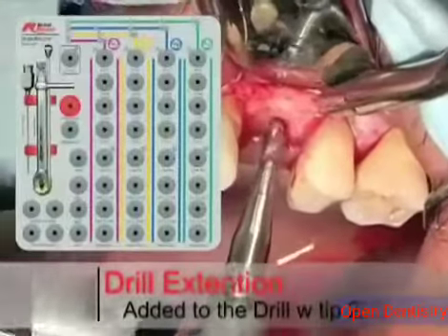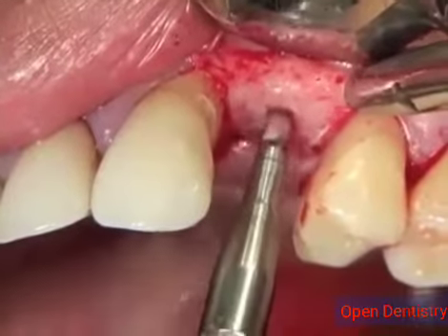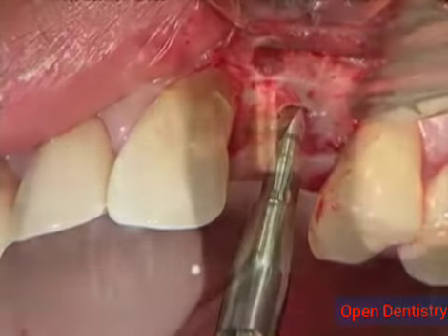Then an extension is added to the 2 millimeter drill, and it is put into position to the optimal length of 13 millimeters, which is the final depth for the implant which was chosen.